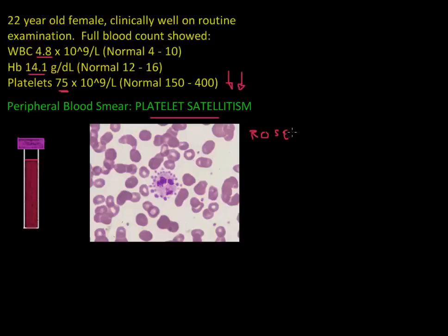The question is: what causes this and does it matter? If we look at the way the blood was drawn, it was taken in a tube containing EDTA. Tubes containing EDTA, as mentioned in some of my other screencasts, usually have purple tops. It's important to note that EDTA is really the culprit here.